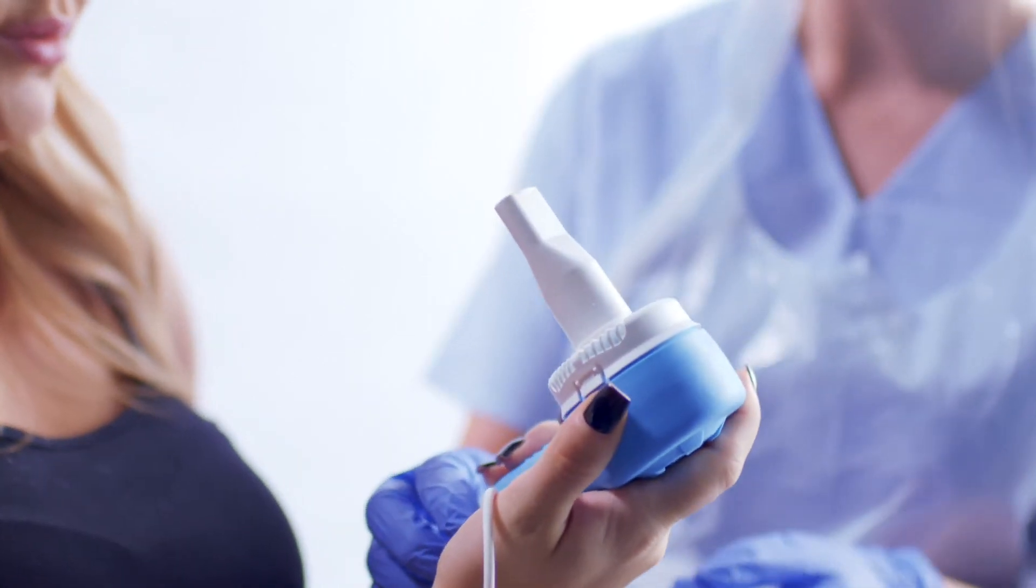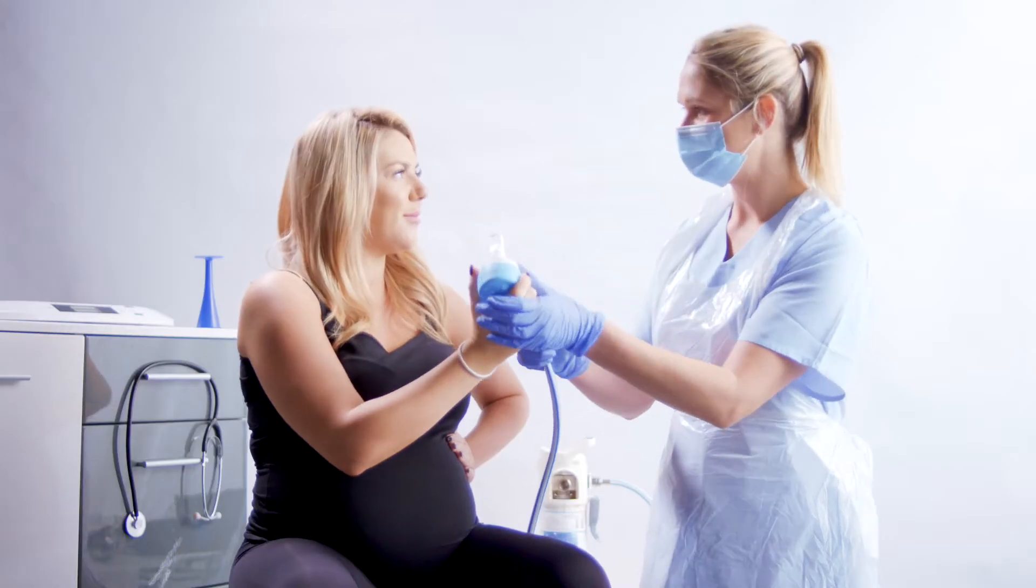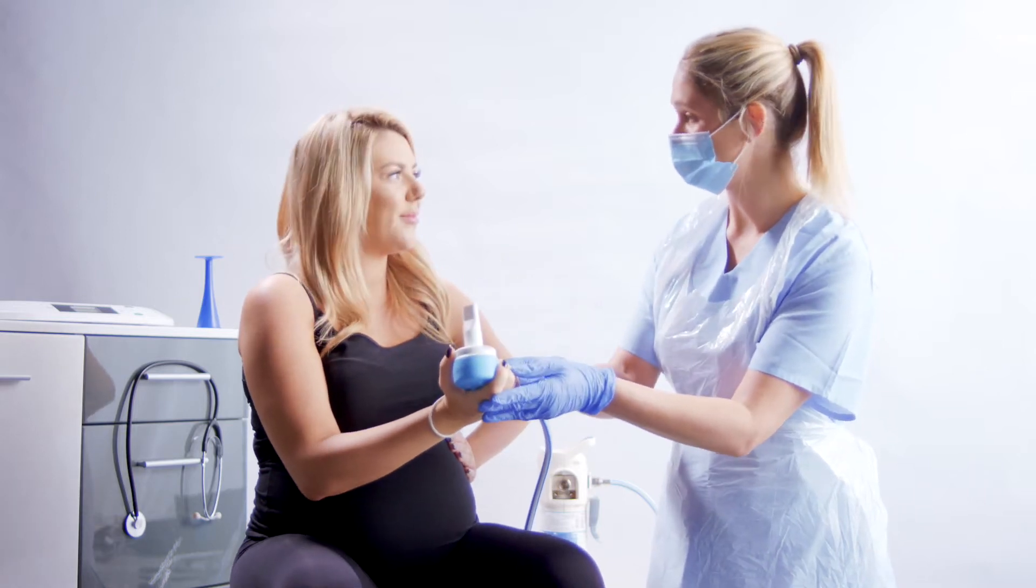Demand valves are used to deliver the analgesic gas, but not all demand valves are equal. Their performance can be important to the outcome of the therapy.